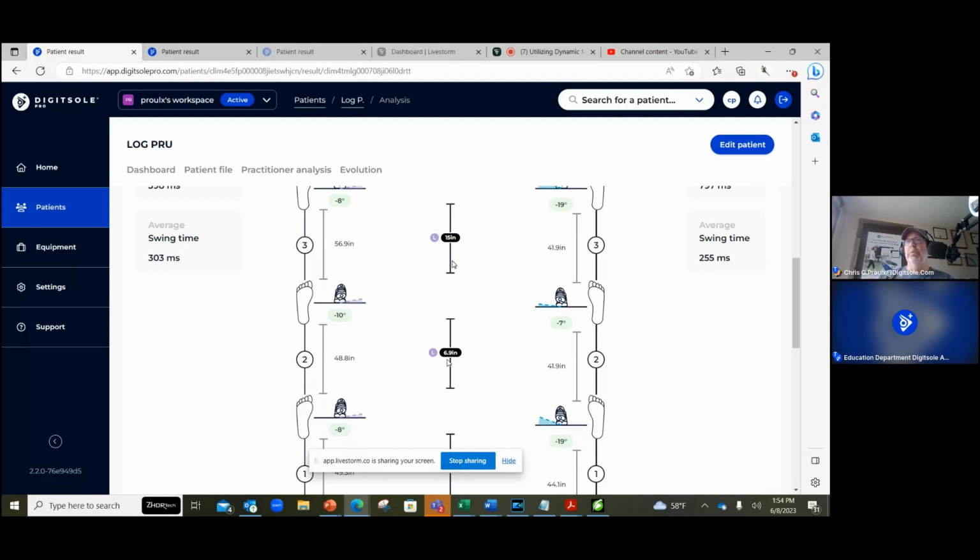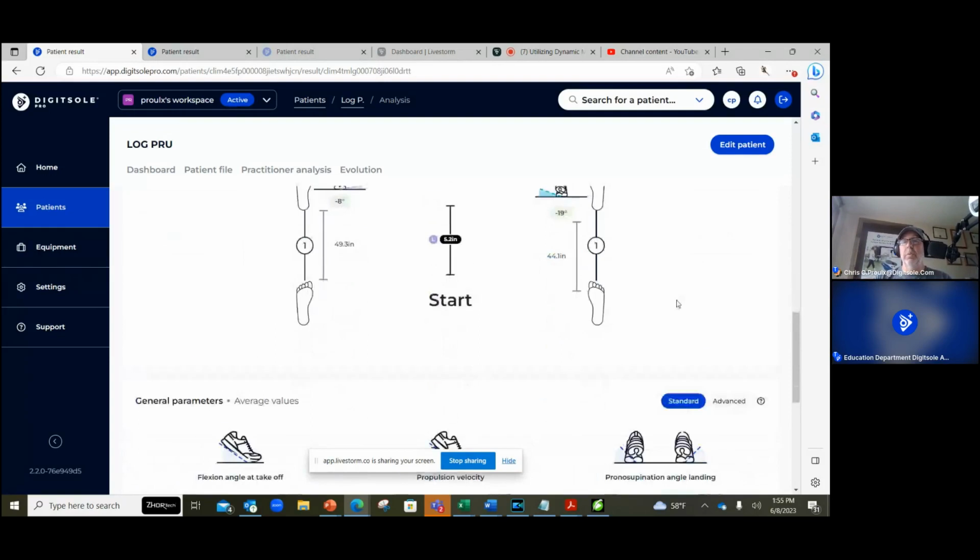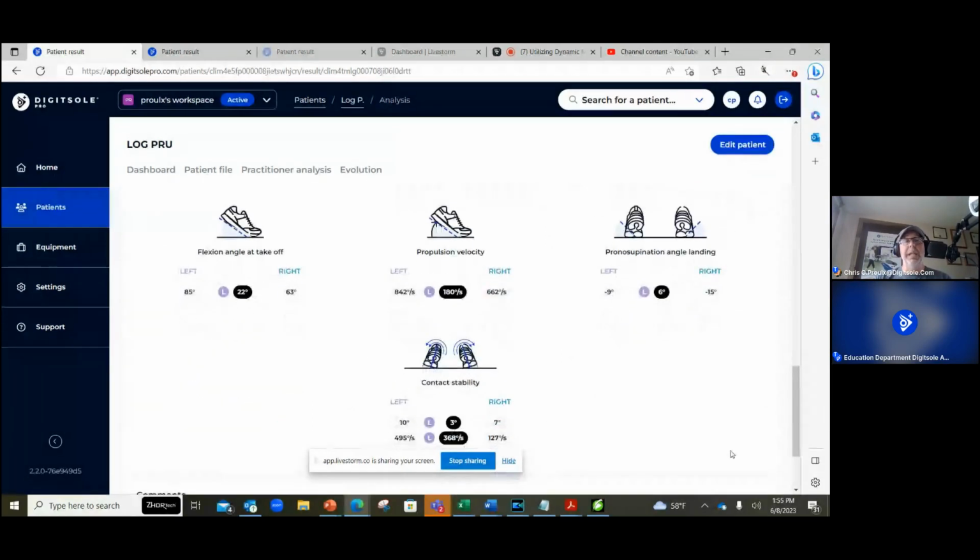Another 15% will perform best on the third trial. 5% will tend to do best on that first trial, right? So that's where, if you're looking for peak values, you're typically going to choose the second, or you average the last two to get your standards. So what I like about this is it gives me the average.